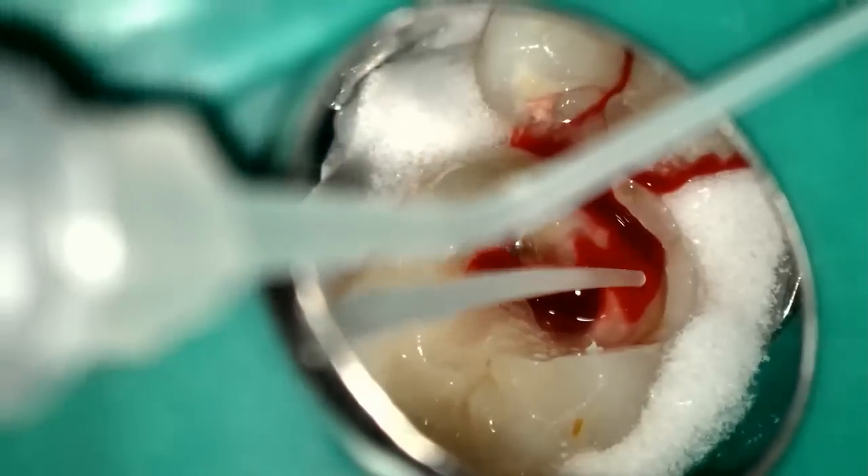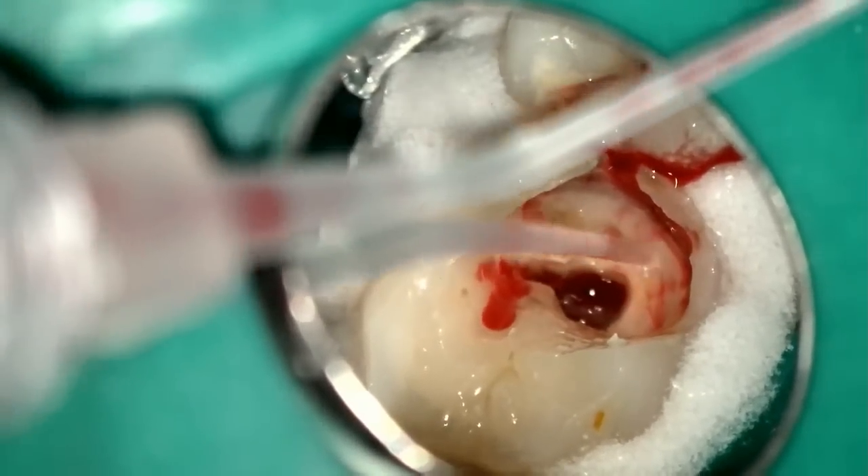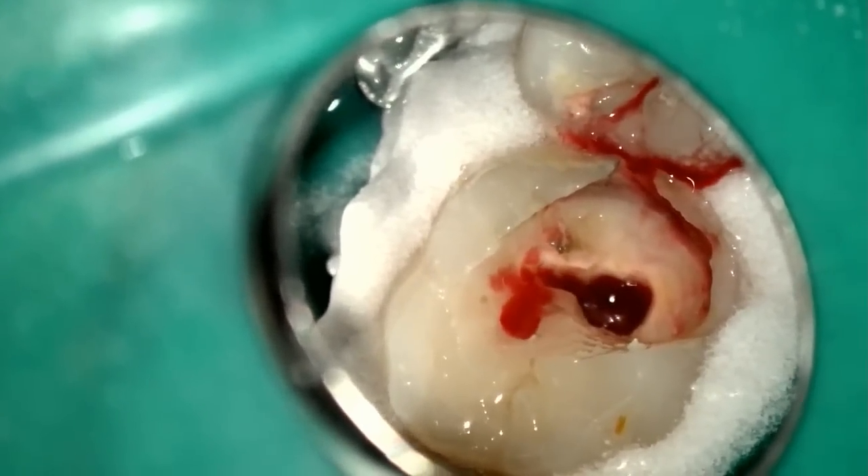Here we have most of the filling removed. We proceed with decay removal as well. Once that's all achieved, we proceed with the actual access cavity. As you can see, the decay is removed and pulp exposure has occurred. Now we proceed to start refining our access cavity.